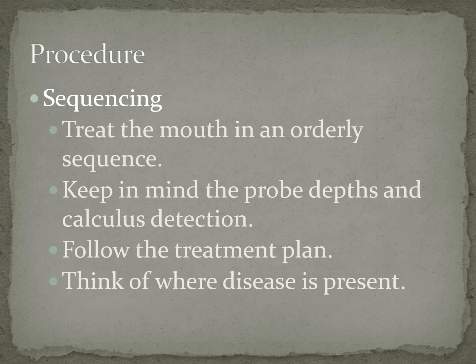So treat the mouth in an orderly sequence, and that also needs to go by what you've treatment planned. So today, if I've treatment planned quad 1 and 2, then I would ultrasonic quad 1. I would go back to quad 1 and go through with my hand instruments, and then I would explore to see what was left. Okay. I would complete quad 1 completely before I would move on to quad 2.